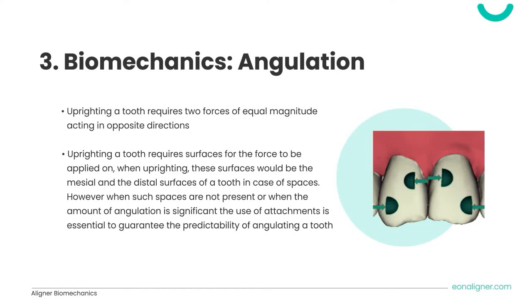However, when such spaces are not present, or when the amount of angulation is significant, the use of attachments is essential to guarantee the predictability of angulating a tooth.